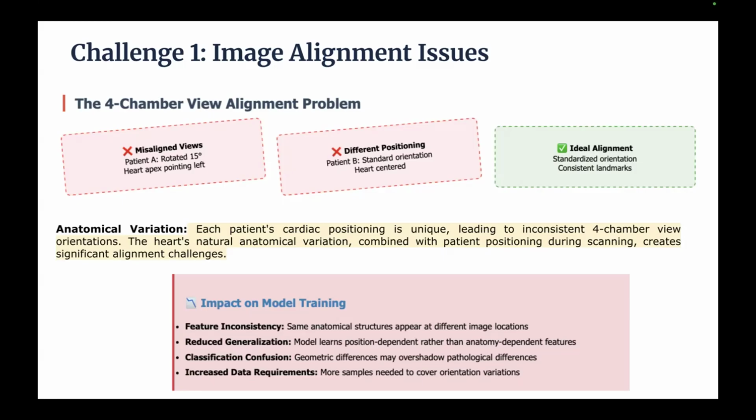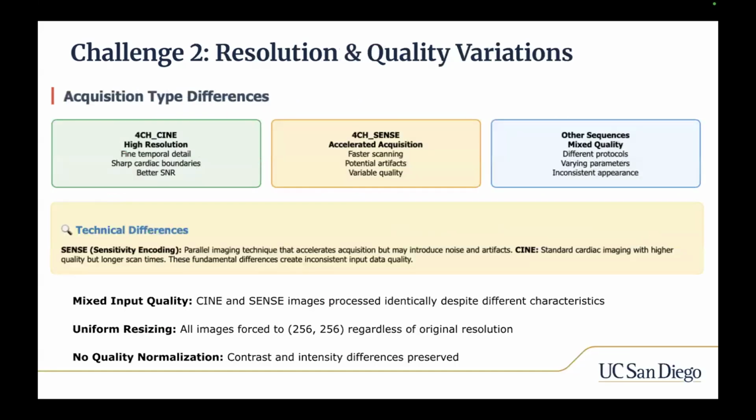And then finally, I think we can combine multiple cardiac views. As we said, this is only the four chamber view. It might reduce our data set, but it may help with the spatial orientation. I think this Z stack helps with that, but maybe another chamber view will help even more.